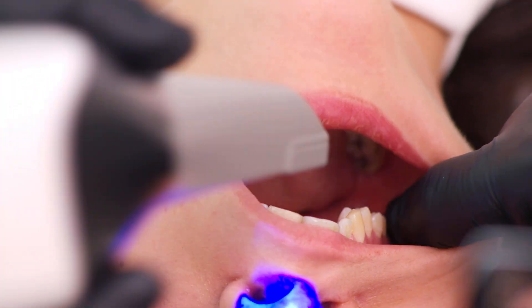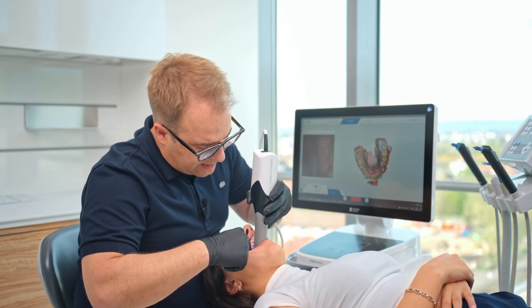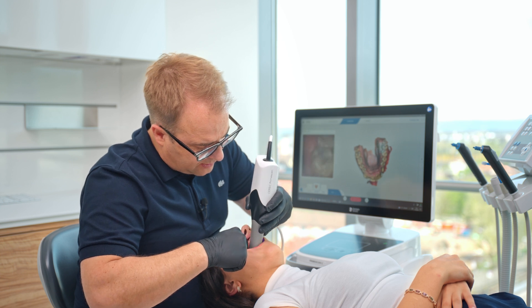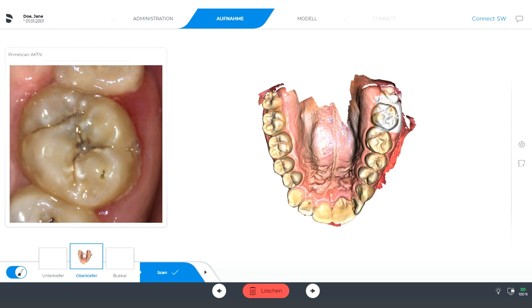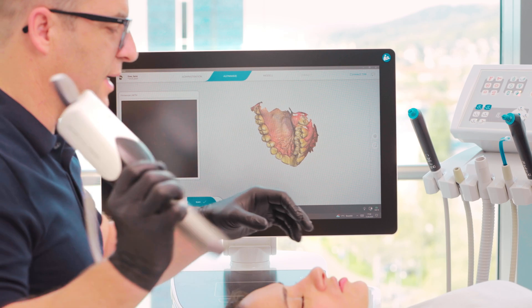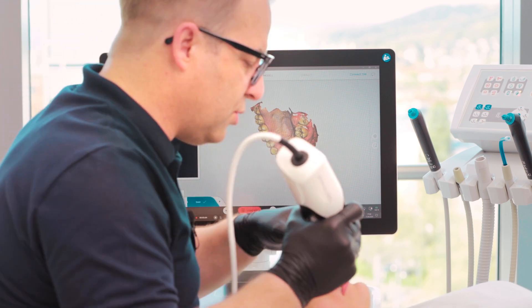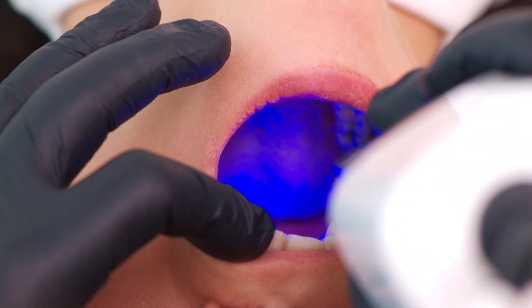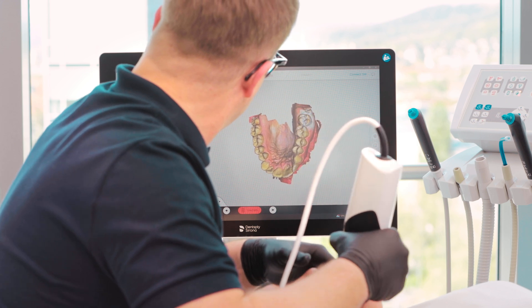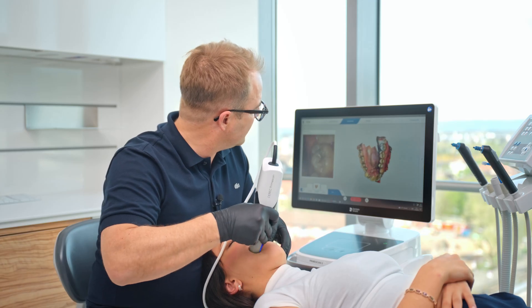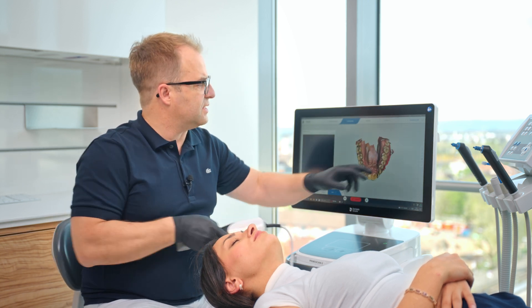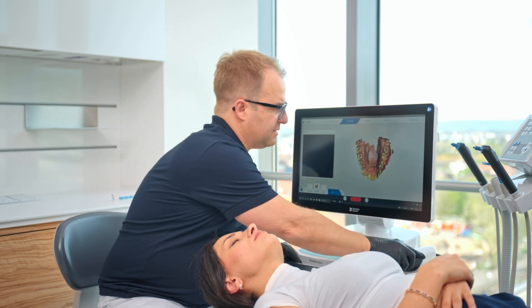Now close a little bit. Move to the right now. Close a little bit. So that's the maximum I can do — I think I will roll over from the buccal. Close a little bit more. Here we go. I think this is enough. Now we have already a very nice upper jaw.